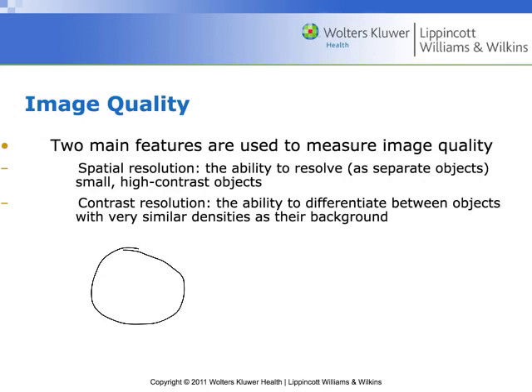And inside of this cylinder, I'm going to have some little tiny lines like this, little tiny lines like this, and maybe some lines that are more spaced out like that. Right? So I'm going to put an ROI over this area here and make a measurement. And basically, the measurement for that should match like the measurement here, because it should be able to differentiate between those sets of lines. Okay? So this would be for spatial resolution.